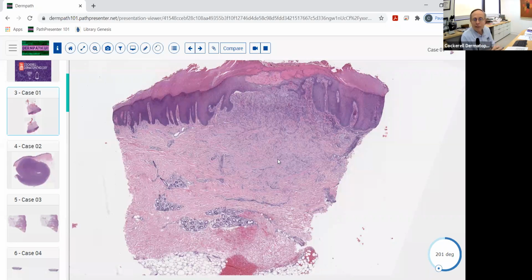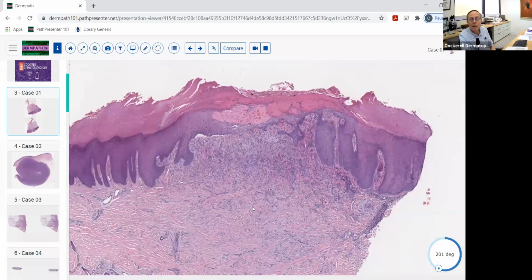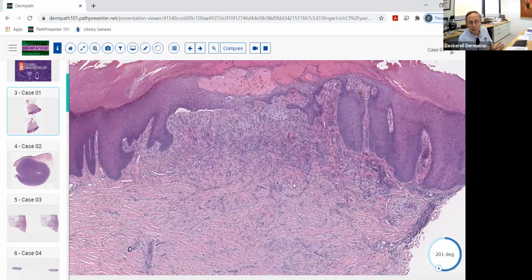And the most common of these is basically scar. You injure somebody, they get a scar, they get proliferation of their histiocytes and fibroblasts. And sometimes if it forms a little nodular aggregation like here, basically dermatofibroma. Okay, that's the most common benign. It's really not a neoplasm, it's really a non-epithelial proliferation of fibroblasts and histiocytes with dilated blood vessels.